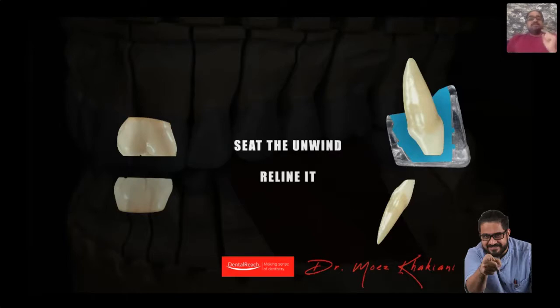Okay. Now, what is the patient supposed to do? On the basis of short, medium, and long-term deprogrammation, the patient is supposed to wear this for a few hours, a few days, or sometimes a few months.